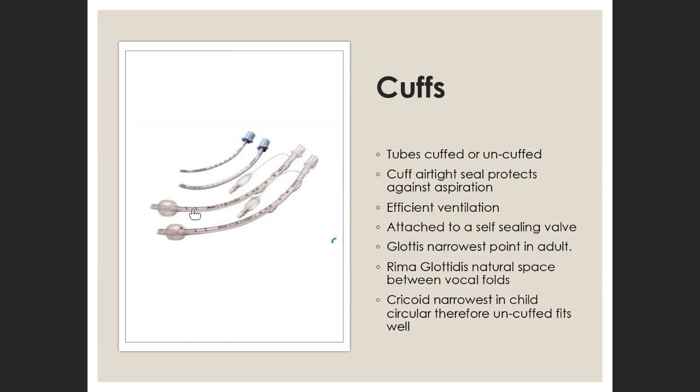So how would we know it's down too far? From the time of intubation, because we're doing it under direct vision, even if we're using a video laryngoscope, you can see where the tube goes and how far it's in. But also along here, remember we told you, in a woman it's 20 to 22 centimeters. It should be in a man no more than about 25, 26. It's actually along the tube. So if I intubate a female patient and that tube is down at 24 centimeters, then maybe I'm in the right bronchus, right? So you have to remember that.